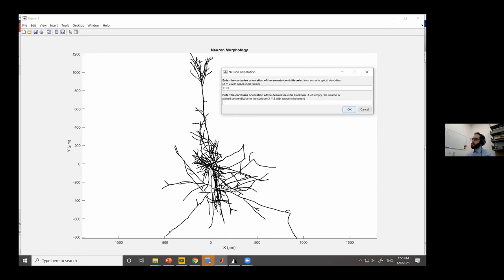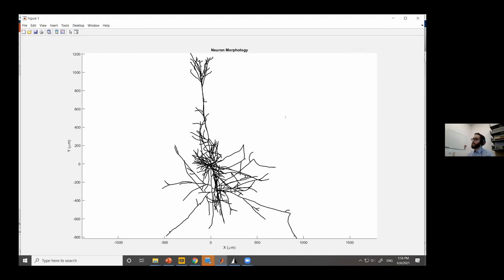You also specify the desired orientation of the neuron — for example, providing [1,0,0] to align along the X axis. If you leave this blank, NEMO automatically detects the orientation and places the neuron perpendicular to the gray matter surface, which is the default orientation of pyramidal cells. I'll go with the default since most pyramidal cells are oriented that way.